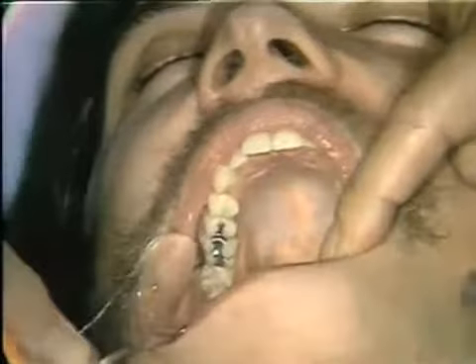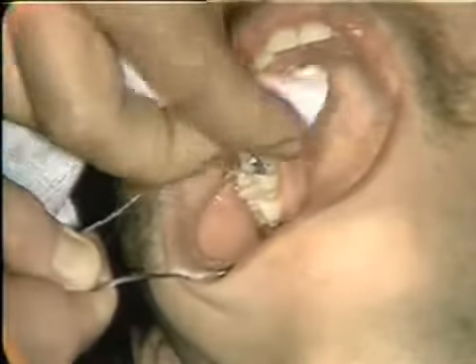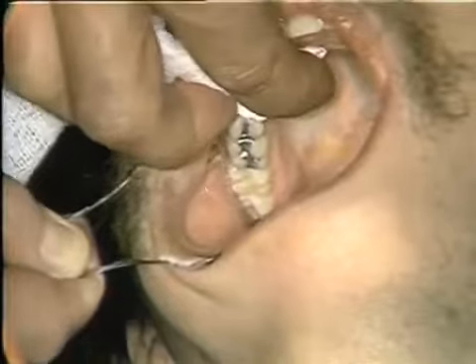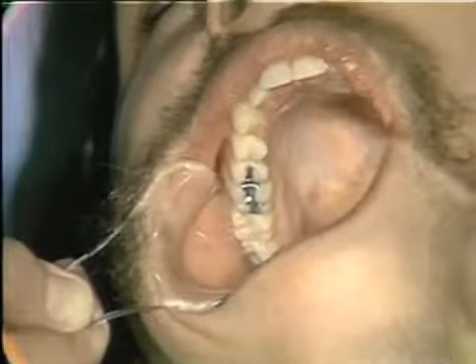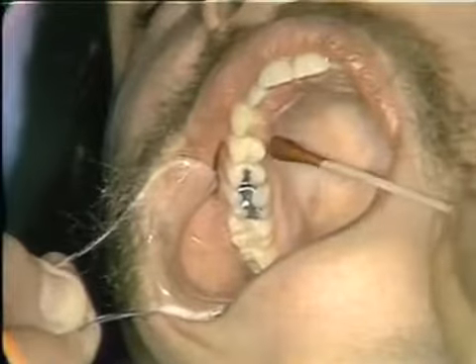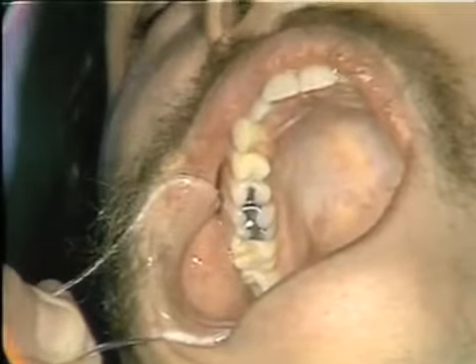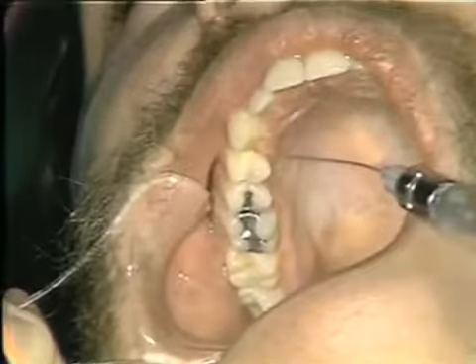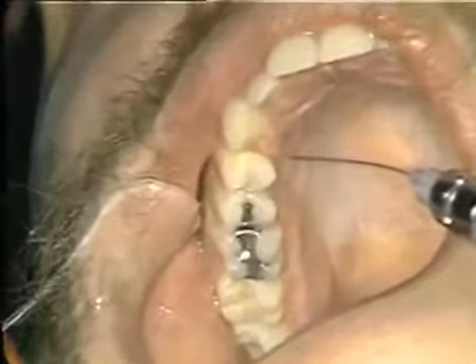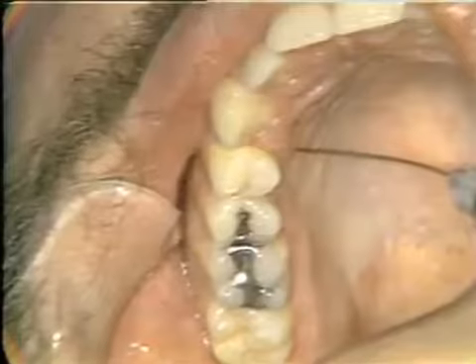Let you slip your retractor in there again, please. And you might turn away from me just a little bit. That's fine. We dry the mucosa, just resting it there for a moment. And then a little tincture of betadine right in the area of the injection, just palatal to the first bicuspid. And then our puncture is made about a centimeter out from the free gingival margin on the palatal surface, in approximately that position. And again, needle bevel carried to bone, and then we aspirate.